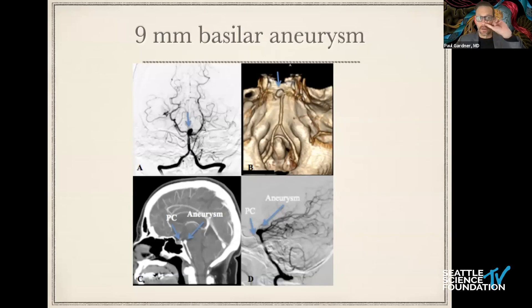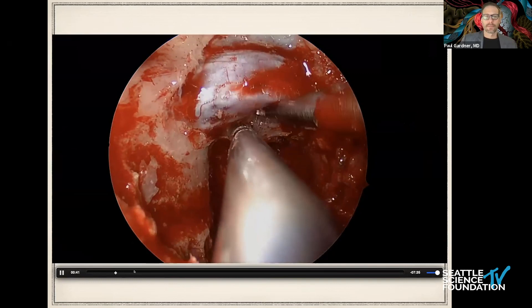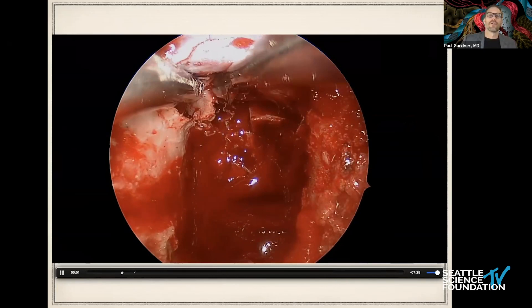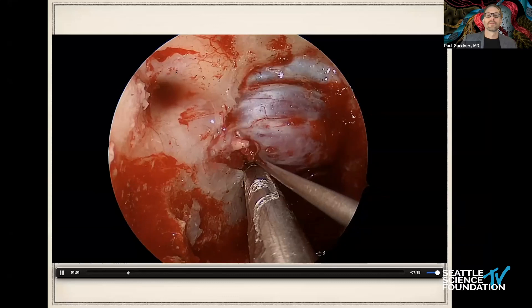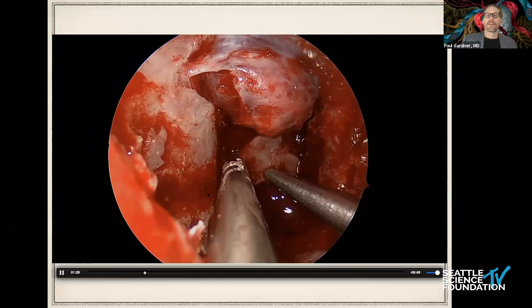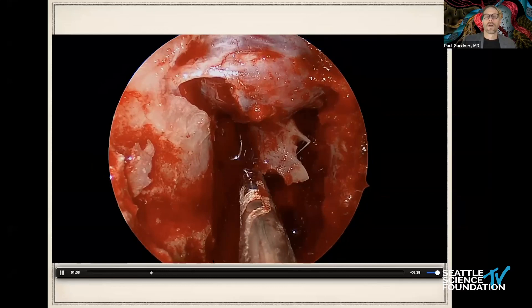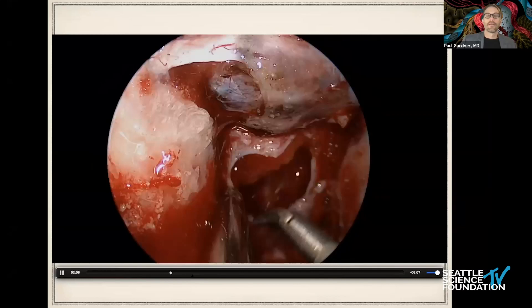Here's a very broad-necked, anterior-posterior, low-lying basilar aneurysm. Using a pituitary transposition and very radical clivectomy, I'm exposing and splitting the dorsum sella in two, then going interdural. Here I've opened the cavernous sinus on the right side with a hook feather blade, dissecting out the posterior clinoid. Then I open the left cavernous sinus, dissecting out both posterior clinoids — you can see both cavernous sinuses open. There's the spike of bone, which is part of the interclinoid ligament attachment. I've resected the periosteal layer of dura and then finally opened the inner layer, giving beautiful access to this aneurysm and the basilar trunk.